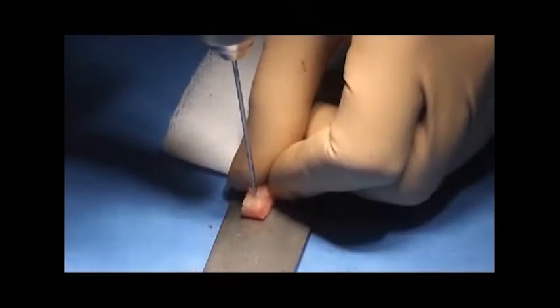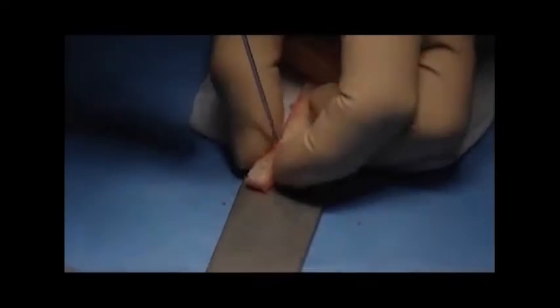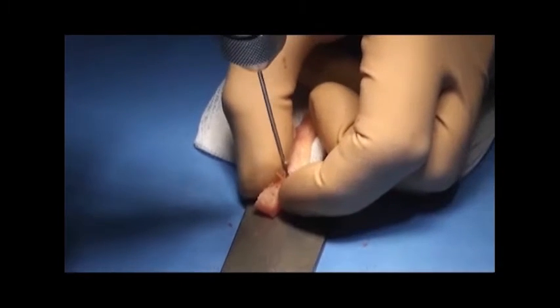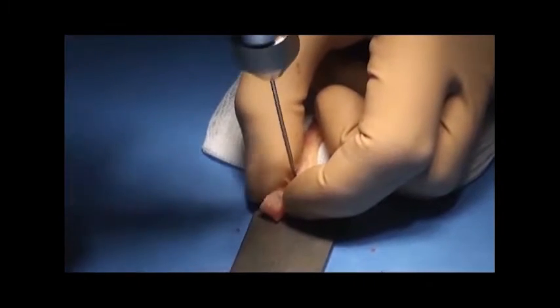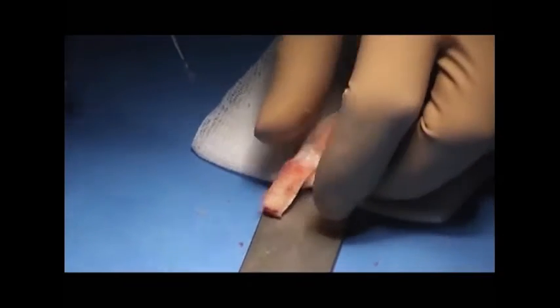Make a first hole by drilling through the middle of the bone block with a 1.5 mm drill bit. Next, drill a hole through the tendinous portion close to the bone tendon intersection. Turn the graft around and repeat both drilling instructions at the other end of the graft.